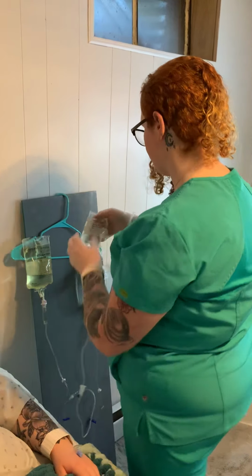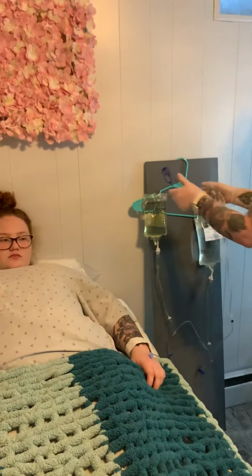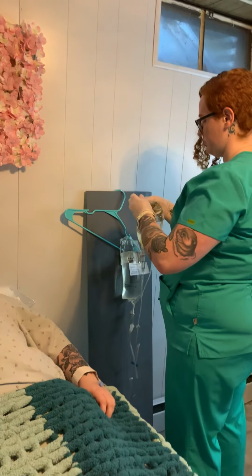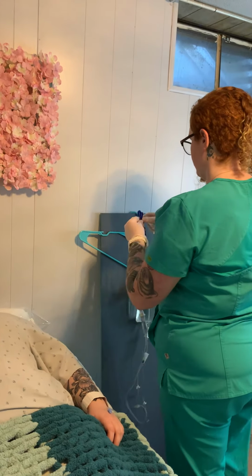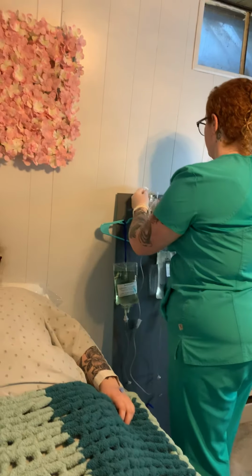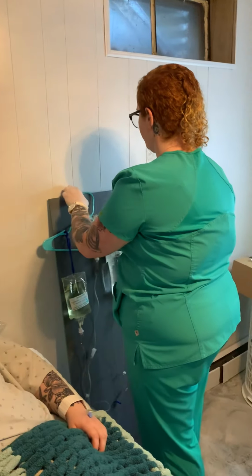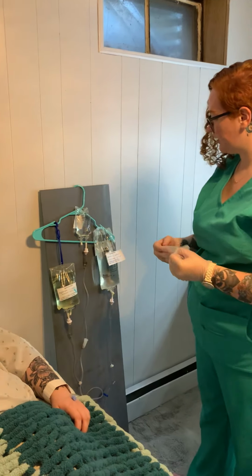All right. We will lower the flush bag. Hang the antibiotic and set the infusion rate of the antibiotic to 200 mLs per hour.